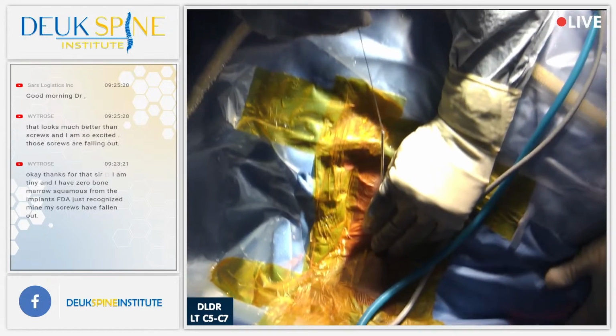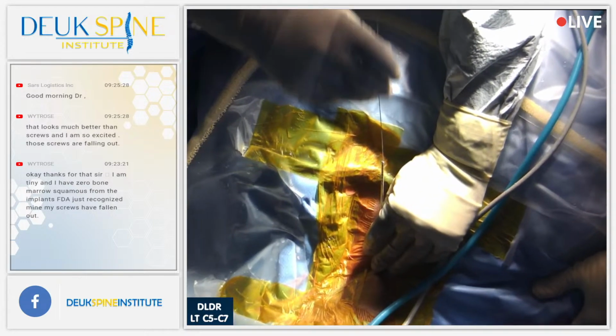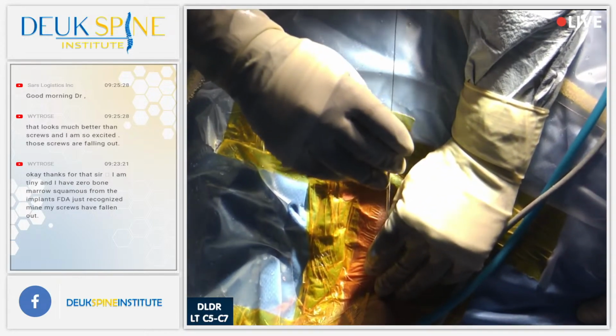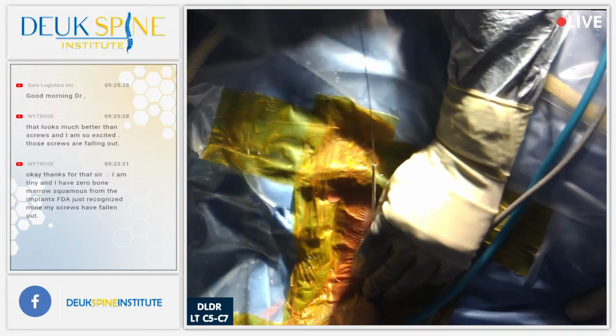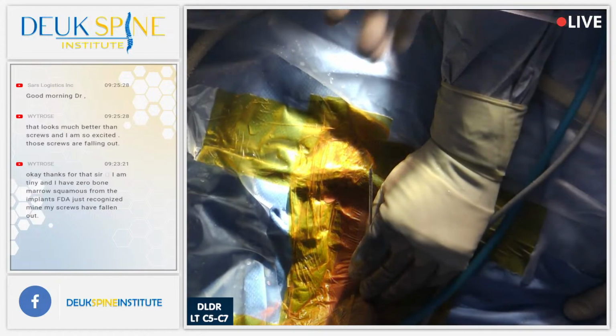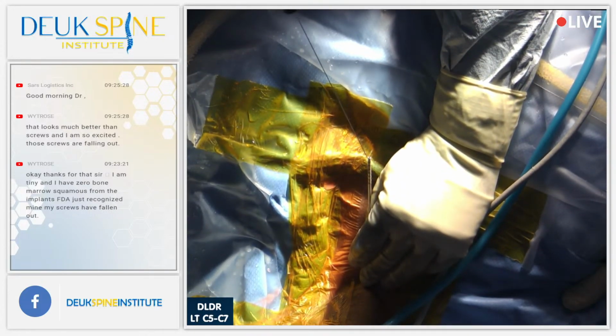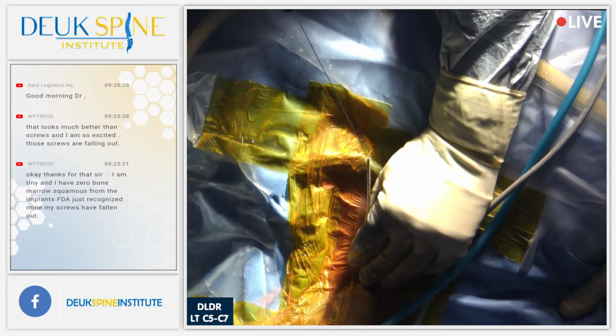Because we want that blue dye. It stains degenerated nucleus pulposus. And let me just say this: the herniated disc itself is degenerated, and the blue dye helps us. The Deuk spine blue dye helps us see that.